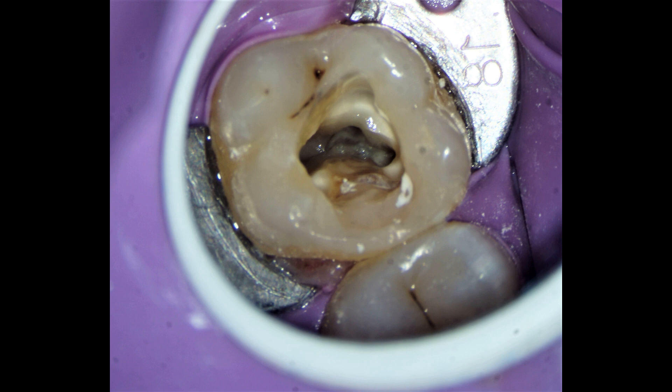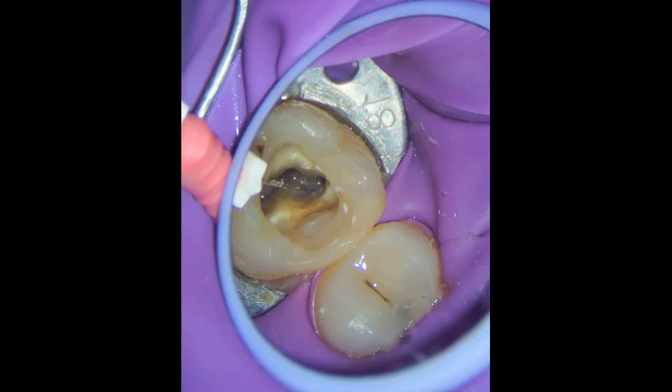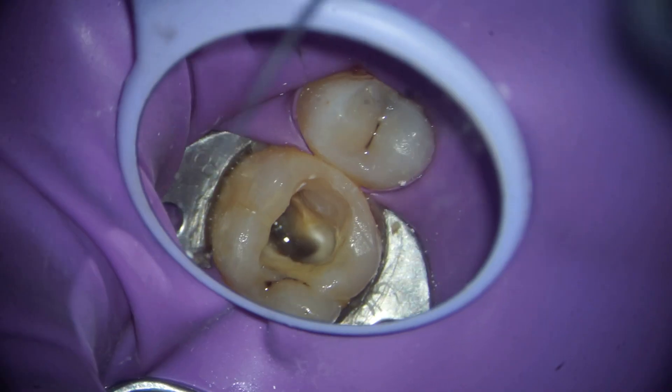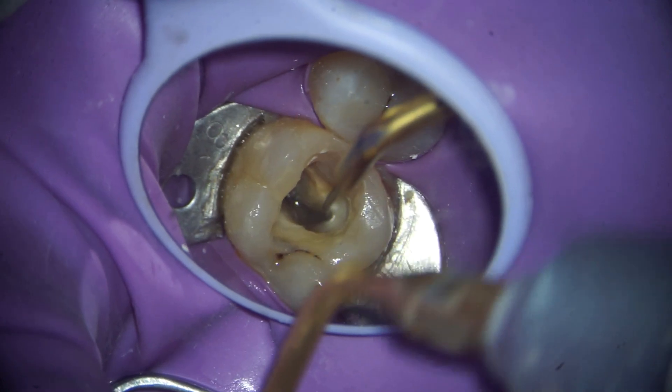We recalled the patient after a week for the final sitting. Our aim was to locate the mesial buccal second canal and then obturate the tooth. In the second sitting, we located and prepared the MB2 canal. Although both canals were confluent at the apex, this was a key finding.